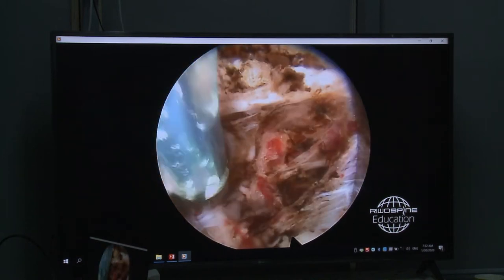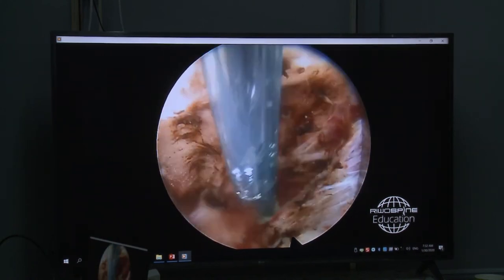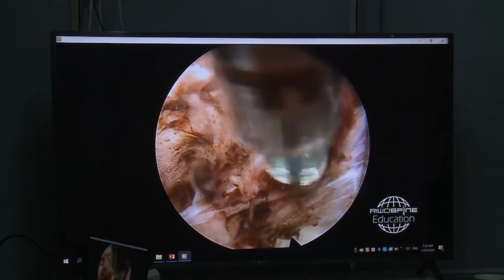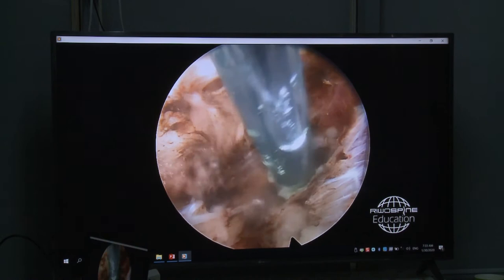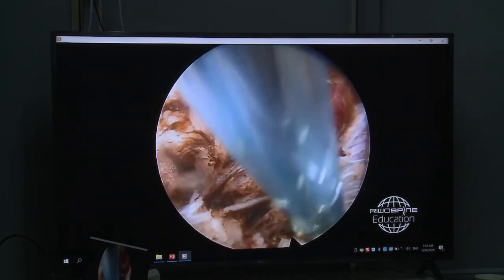Here, this is the facet joint. We operate on the left side, that means the left is cranial, the right is caudal. Here's the disc. We have to coagulate the vessels very well, so that it does not start to bleed.